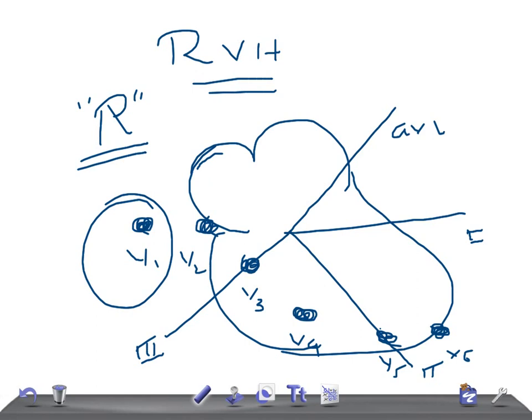We know that the R waves increase in height from V1 to V6. As you proceed from V1, V2, V3, V4, V5, and V6, the R waves keep on increasing in height. That's why the R wave will be very big in V5 and V6 - it has reached the maximum.